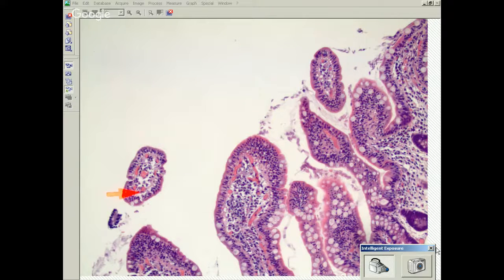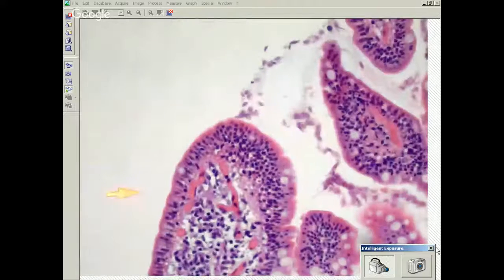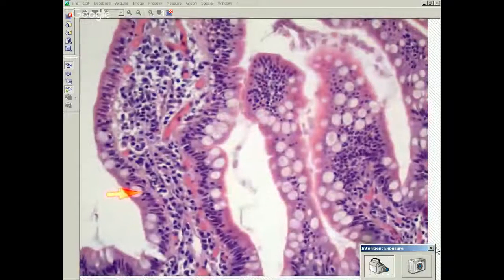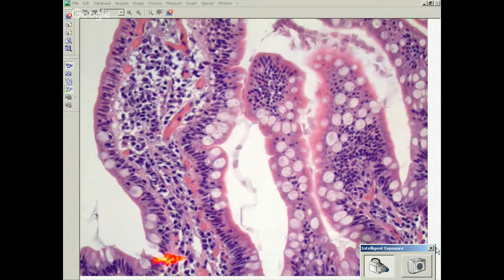The final thing that I always look for is plasma cells in the lamina propria. Why would I look for plasma cells in the lamina propria? What entity does not have plasma cells in the lamina propria? Anybody? CVID. That's right. CVID, you should not see plasma cells in the lamina propria. But here, actually, we see quite a few, which is normal. You can see them here.